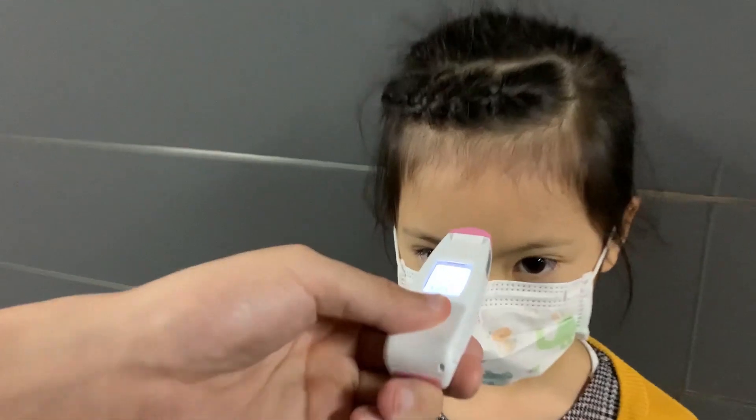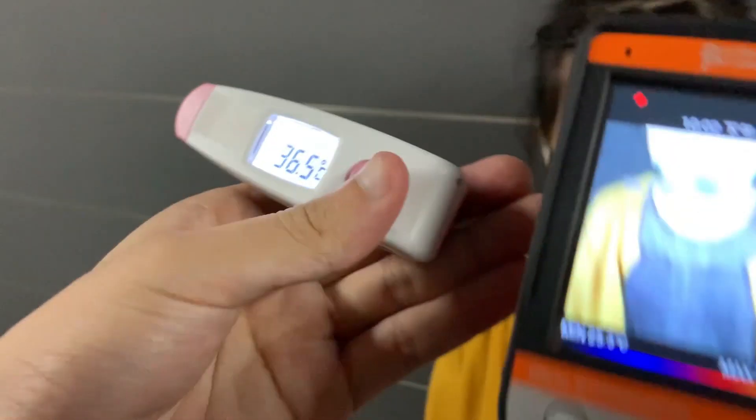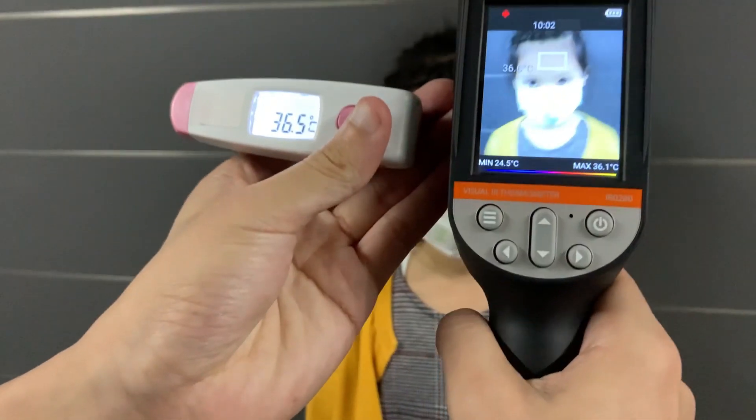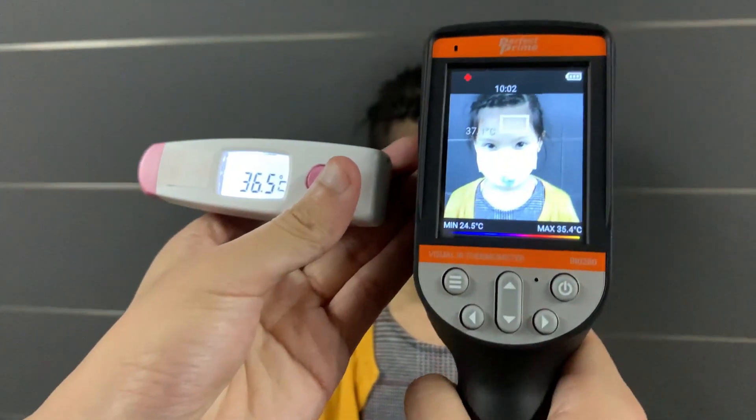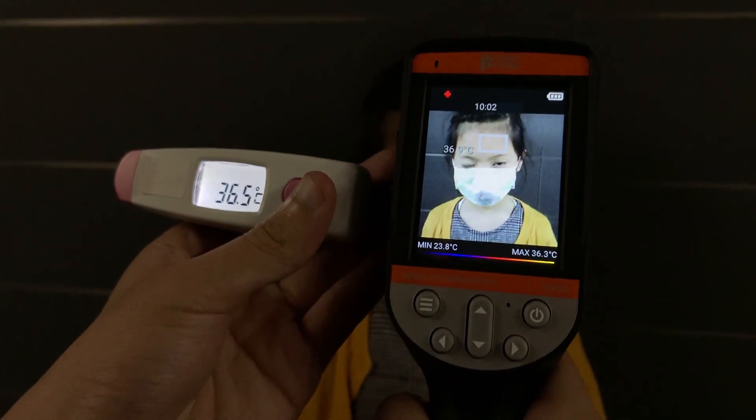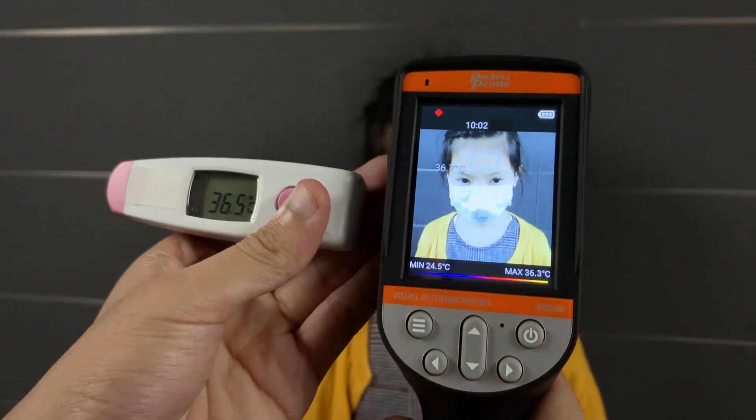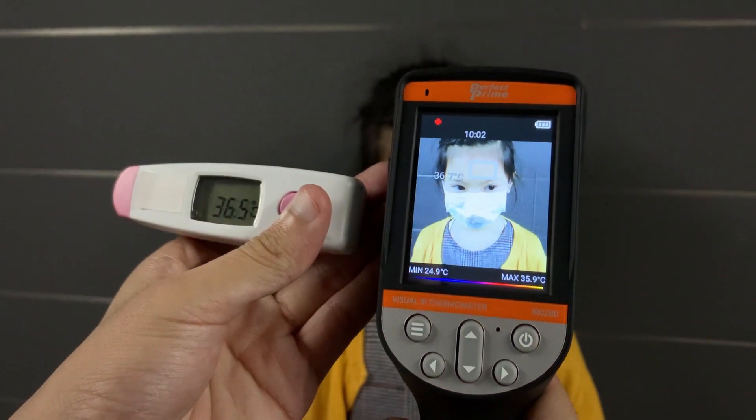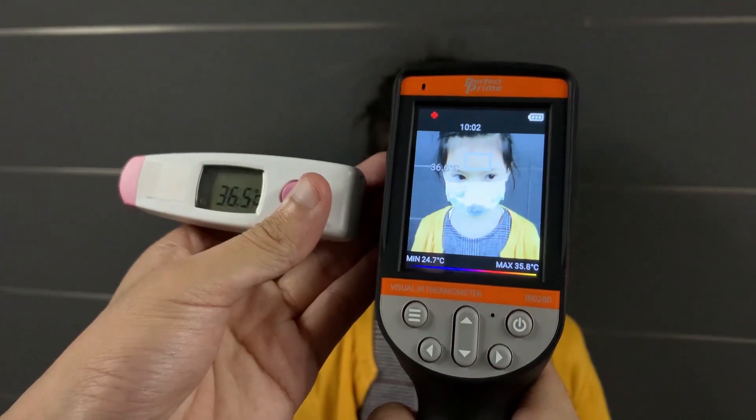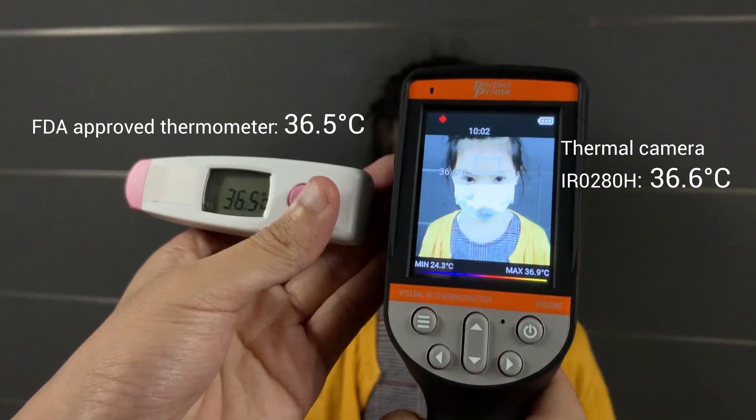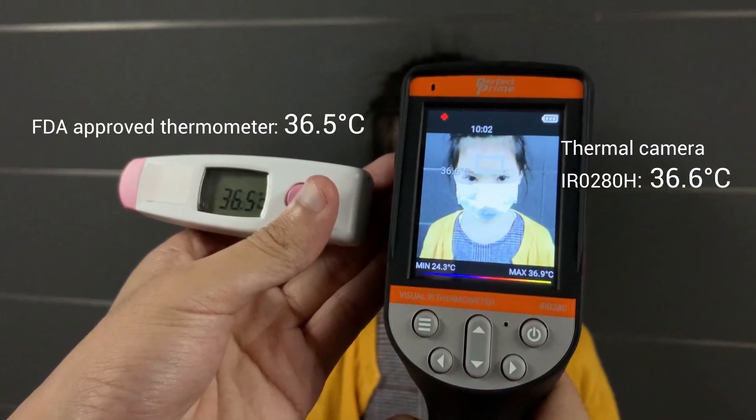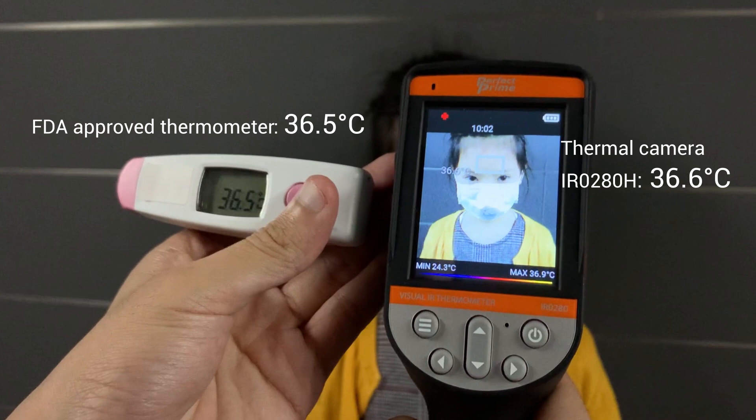Most thermal cameras have an accuracy rate of 2 degrees Celsius or 2%. This can leave room for error. The IR0280H has an accuracy rate of 0.3 degrees Celsius. And when compared to an FDA approved laser thermometer, you can see the results are quite close.